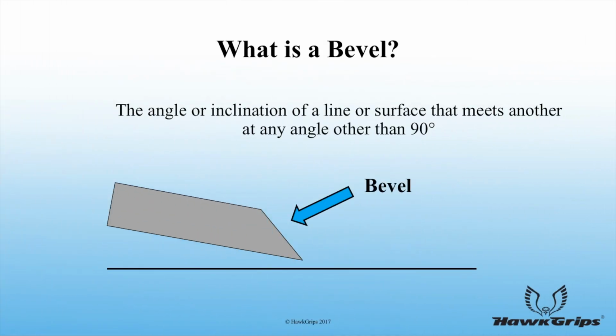To understand how the instrument should be used, the clinician should understand a bevel. A bevel is the angle or inclination of a line or surface that meets another at any angle but 90 degrees.